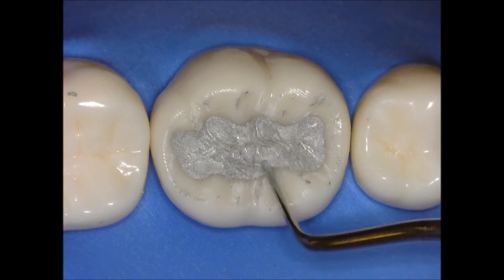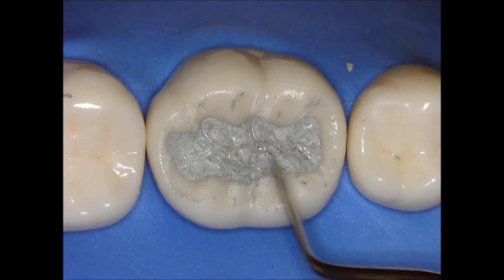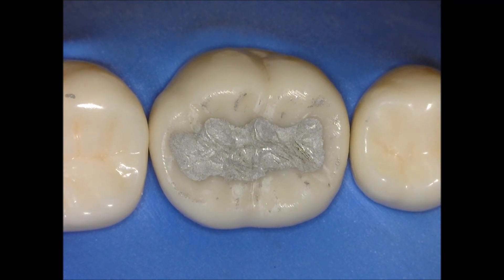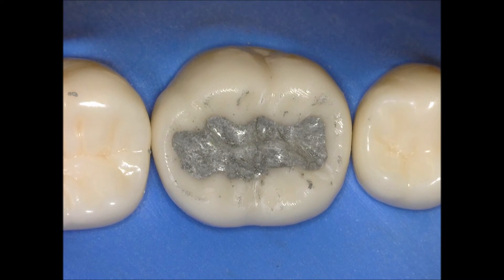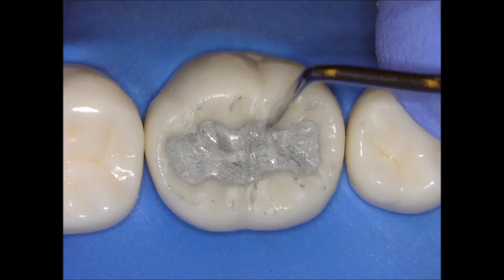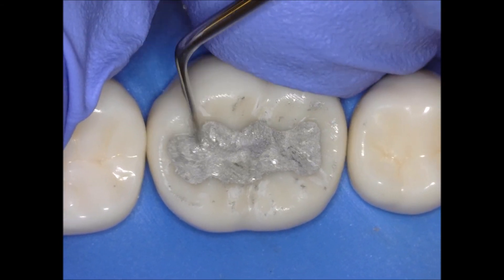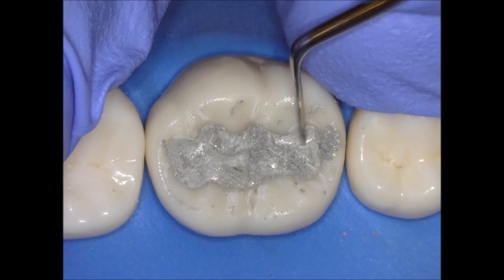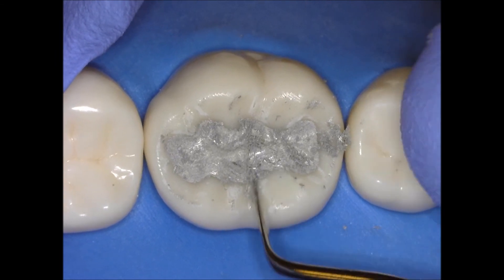Another important point: always make sure that your cavosurface margin is clean and you don't have any submargination. At this point you cannot add any more amalgam — it's basically just carving. I'm cleaning up a little bit more with a micro brush, which will smooth the surface. Using the Hollenbeck again, carving just the triangular ridges, and I'm starting to create anatomy on the occlusal table. Just by carving those triangular ridges, it's giving me the central groove. I'll do the same thing with the lingual cusps.